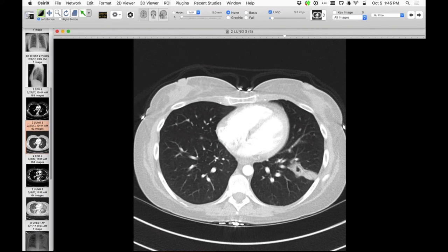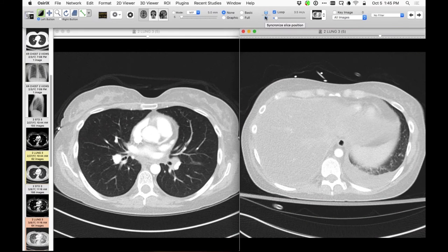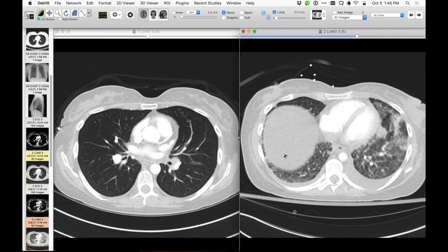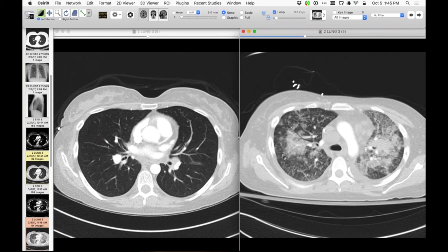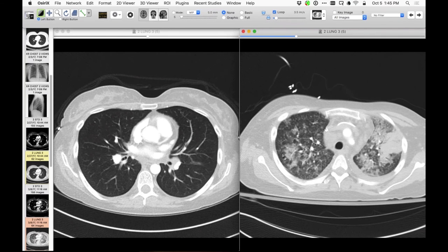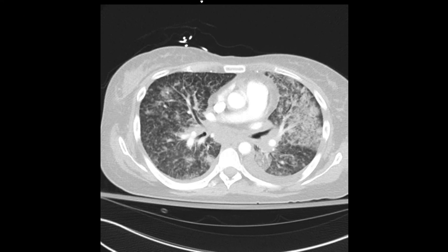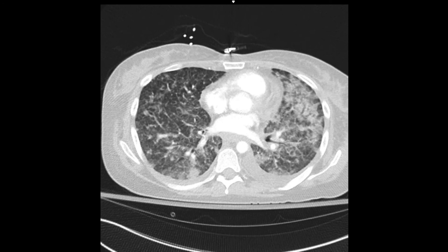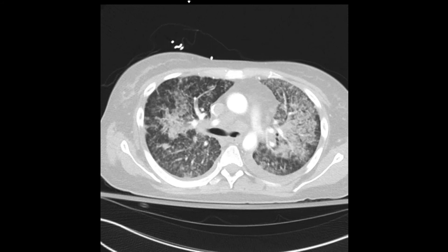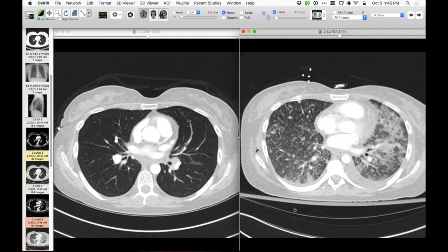But then in March, in contrast, she gets very sick, and you will see that her lungs now look pretty awful. There's a lot of unsharpness from breathing, but you can see now there is a diffuse consolidative process in her lungs. If you try to look through the blurring from the respiration in the sick patient, I think you might get the idea even here that there are some background little nodules in between. But I'll show you more of that in a bit. And she has pericardial fluid, so she's very sick at that time.